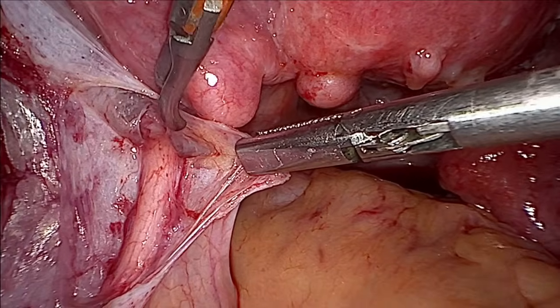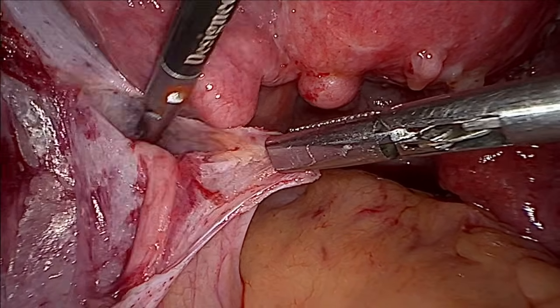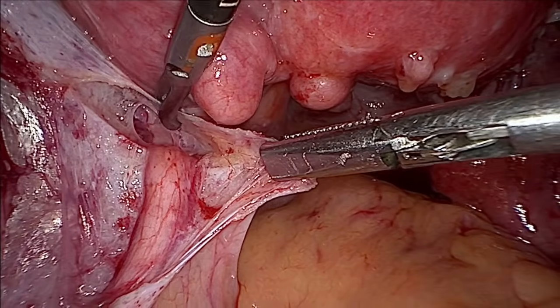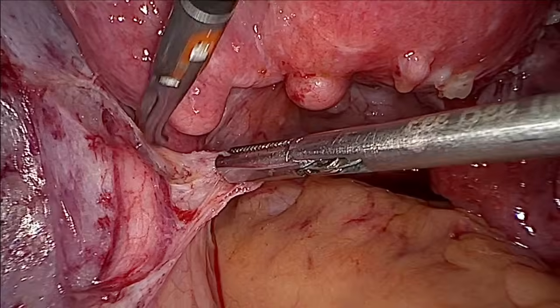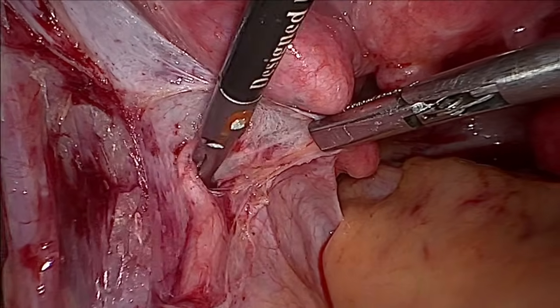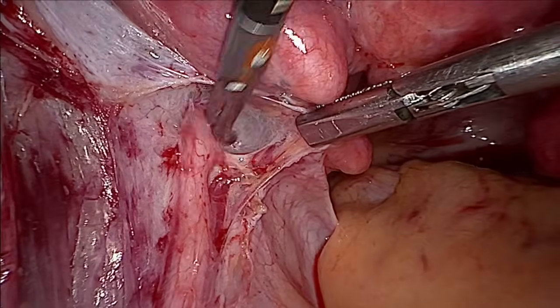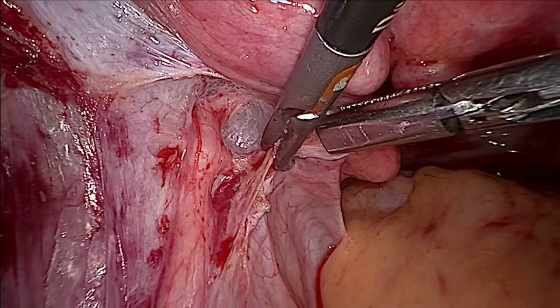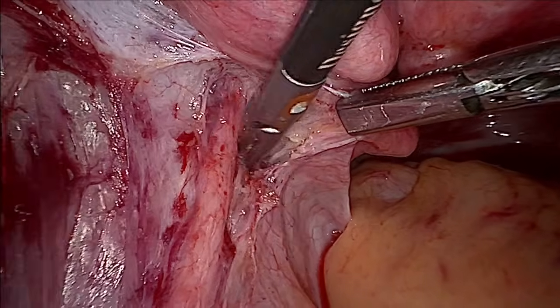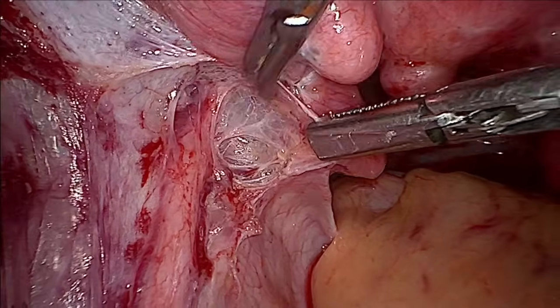Try to preserve. In a case where there is not much endometriosis and there is only a superficial peritoneal endometriosis, try to preserve this adventitia. You can just go with a very blunt kind of dissection. You can see this. Try to preserve.